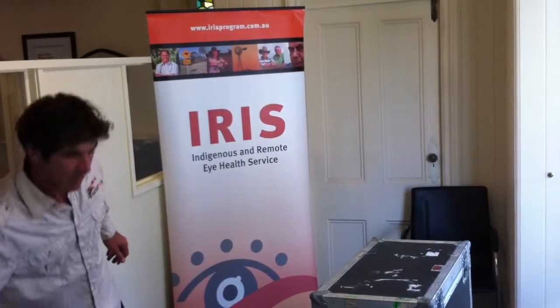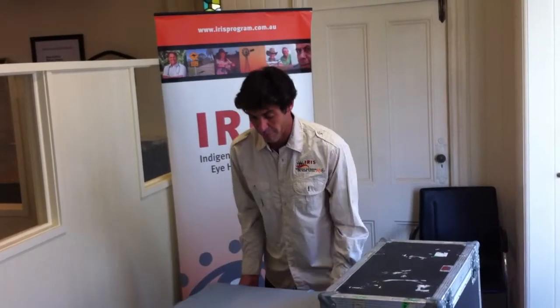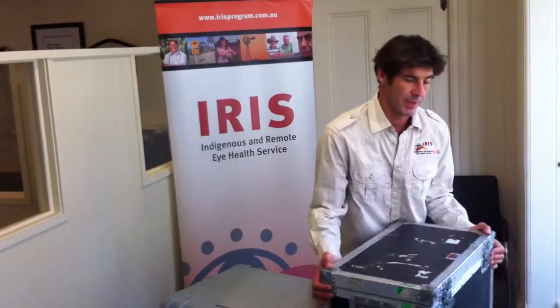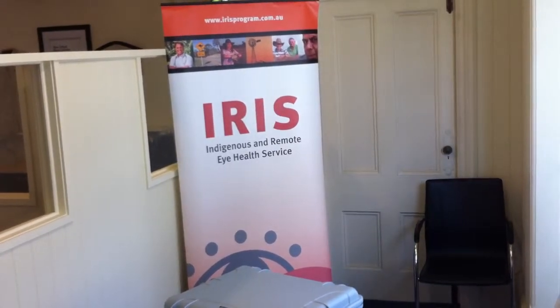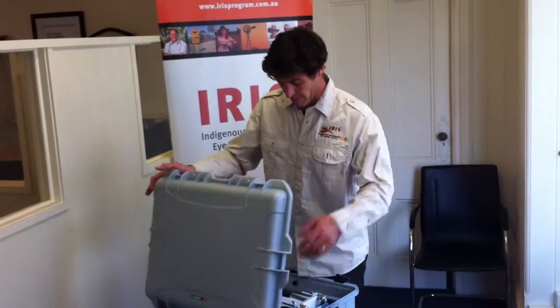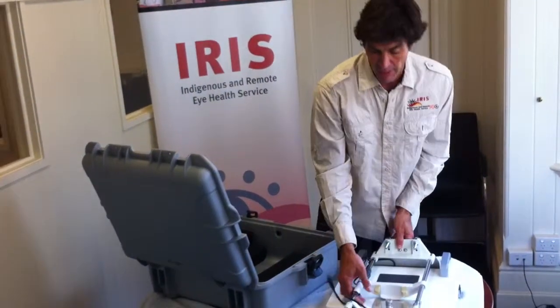With some funding organised by IRIS and my design, we have built a portable slit lamp table. This one table here weighs 13 kilograms, and as you'll see in just a matter of minutes, we can set up a slit lamp to be used in just about anywhere.